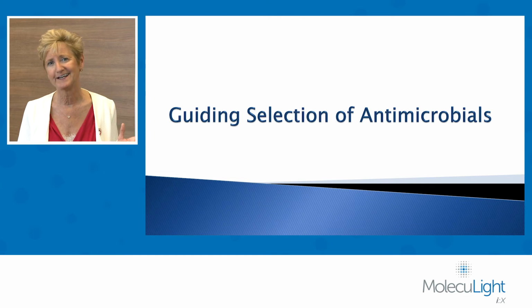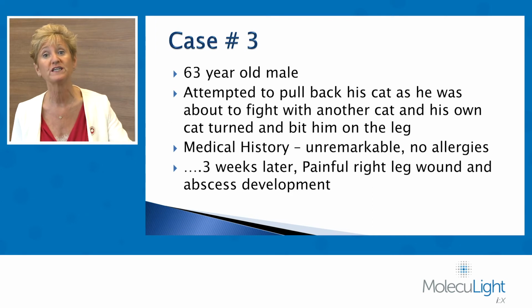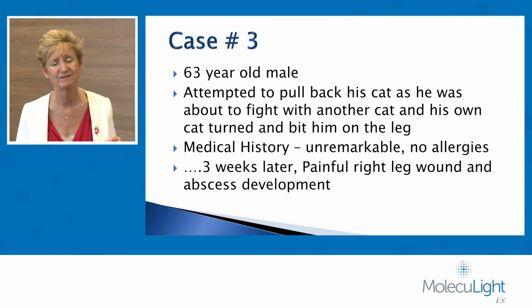Sometimes the MolecuLight also guided some of our antimicrobial use. And I want to tell you about this 63-year-old fellow. He had a cat, and his cat was about to get into a fight with another cat. So he quickly retrieved it, and it was strange and unexpected for him, but the cat turned on him and took quite a nasty bite out of his leg.